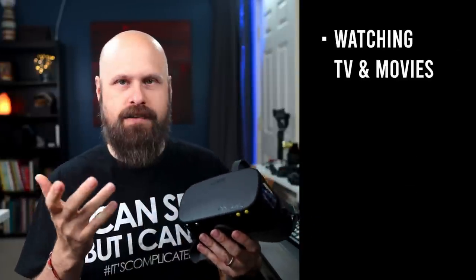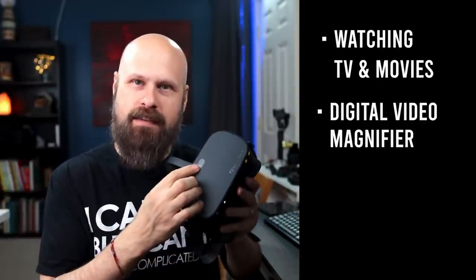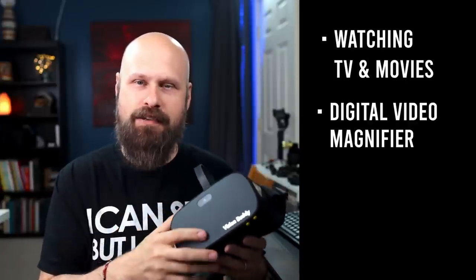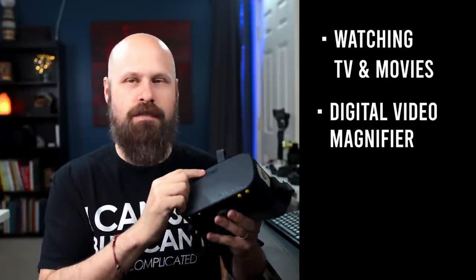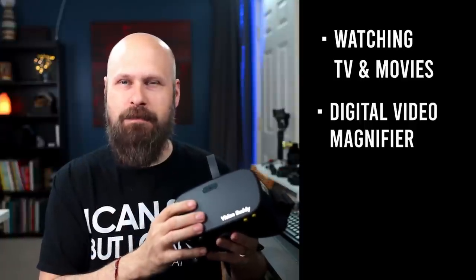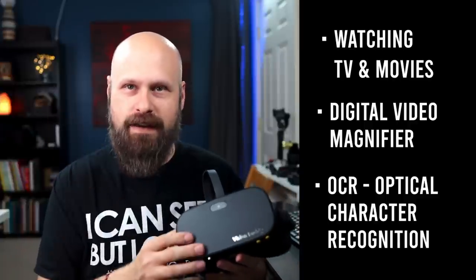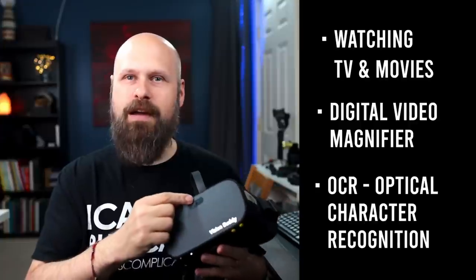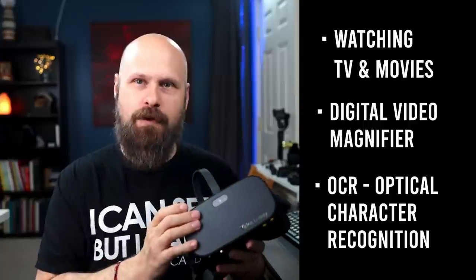The Vision Buddy isn't just for watching TV and movies — you can also use it as a digital magnifier. It has a 16-megapixel camera that you can use for video magnification; that's one of the updates in this latest version. Vision Buddy can also do OCR, optical character recognition — that's text-to-speech. You can use the camera to snap a picture of a text document, a sign, or a price tag and the Vision Buddy will read it out loud to you.